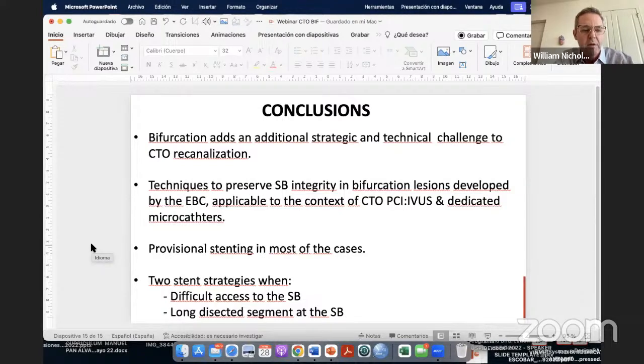So I'm curious, in the States, and I know it's not looked at favorably at all outside of the US, but STAR techniques are used a lot in these situations, and we've gotten pretty good at having a balloon in the main branch going out the branch that we've crossed.